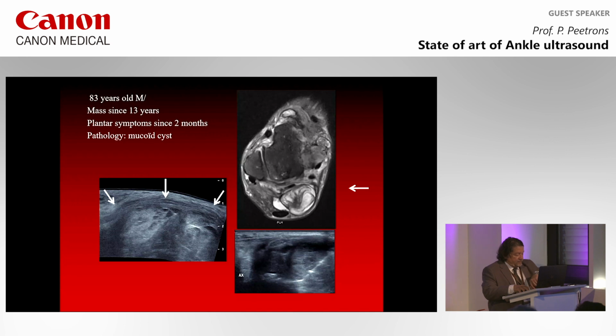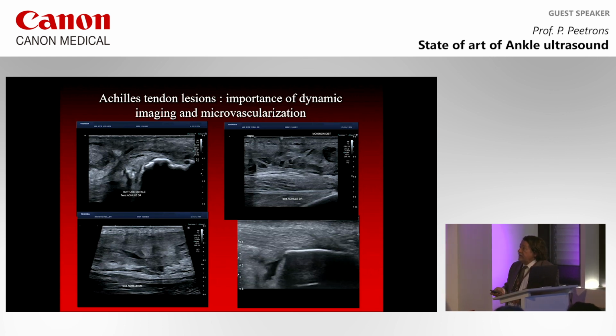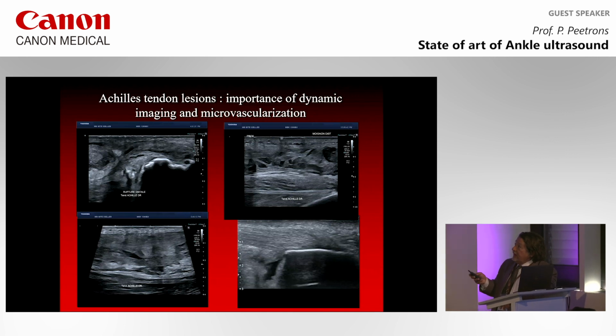It's now 45, and I'll show you what is also important to do when you have a tendon lesion. So you have dynamic imaging and microvascularization imaging. Dynamic imaging tells you what happens in these 4 Achilles tendons.